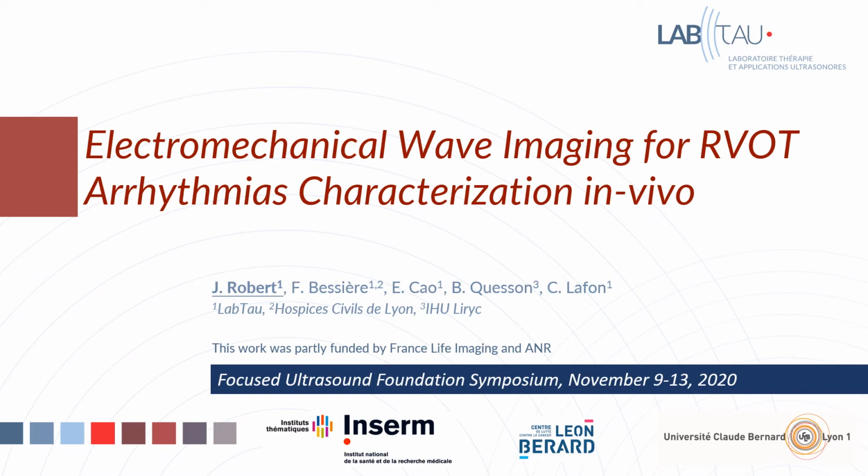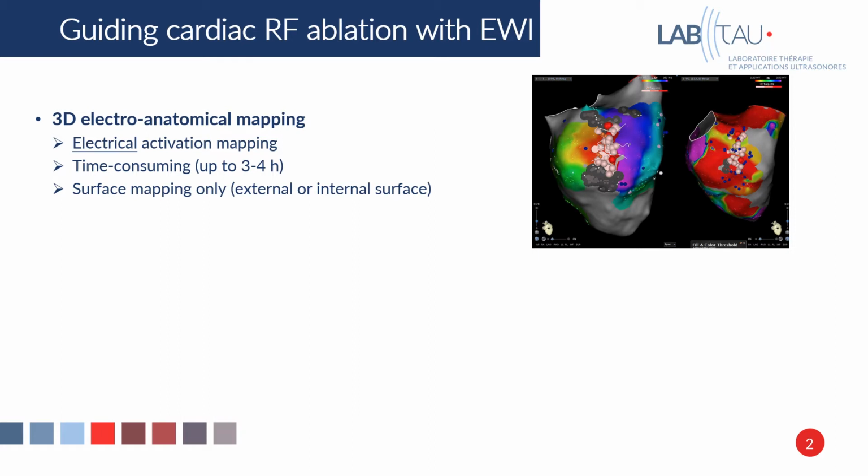Hi everyone, so today we will be talking about electromechanical wave imaging. We are interested in electromechanical wave imaging in the scope of guiding cardiac arrhythmias RF ablation.